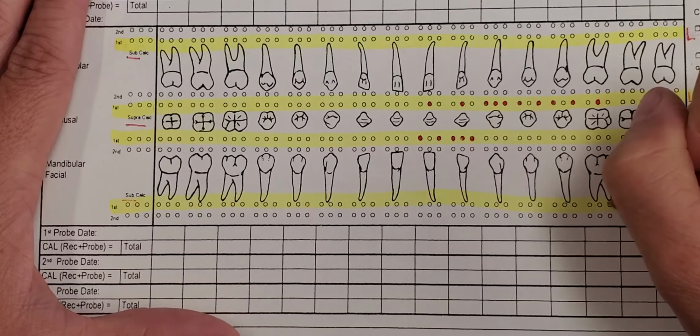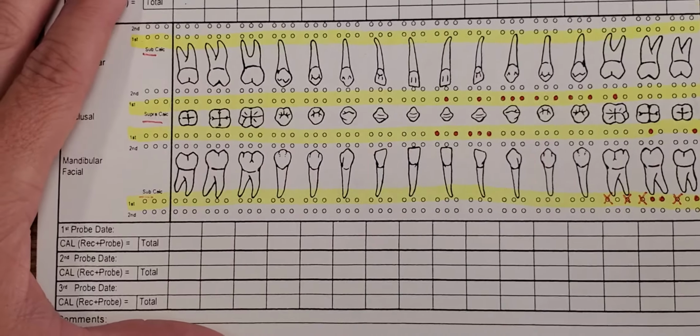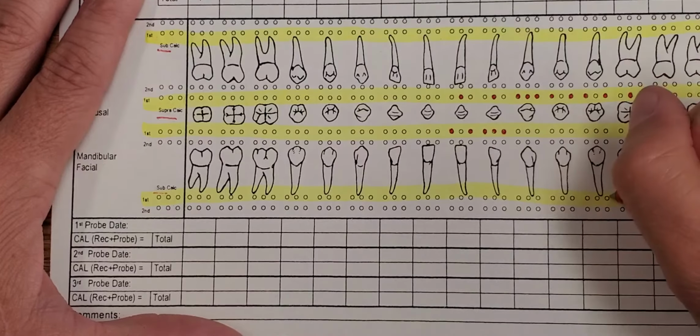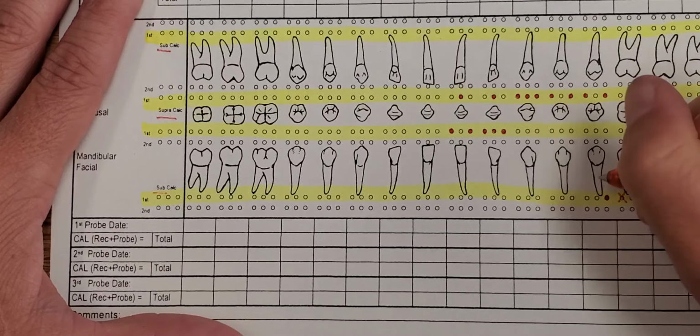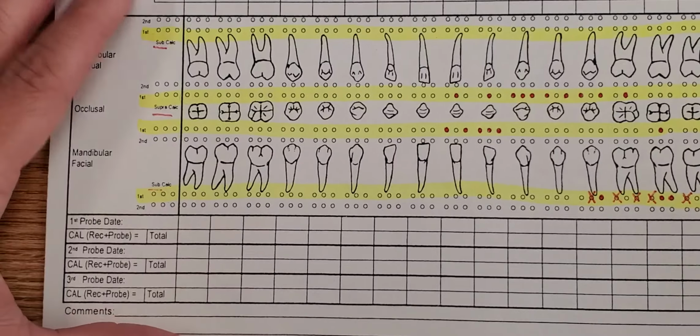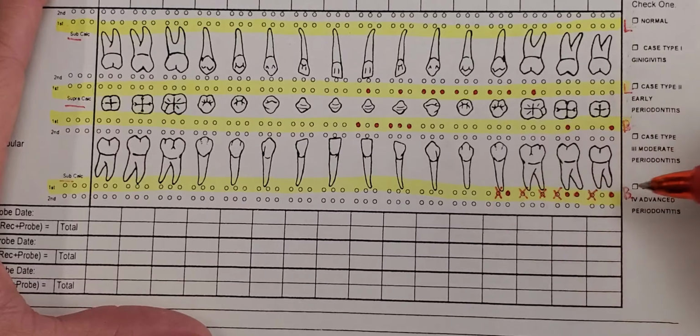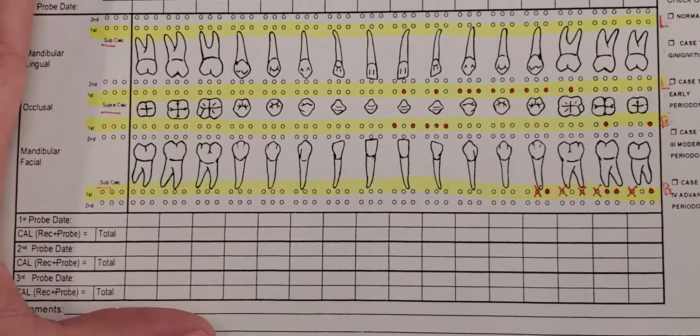Number 19, definite on the distal and the mesial. Number 20, roughness, distal. Straight facial, definite. Now this is quite a bit of calculus. You might not find that on your lab partners, but you will eventually.